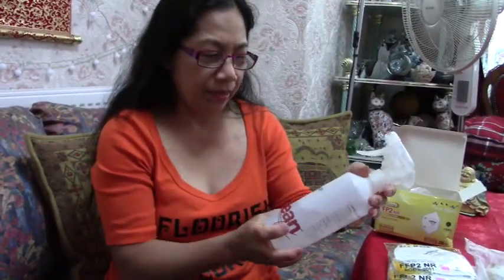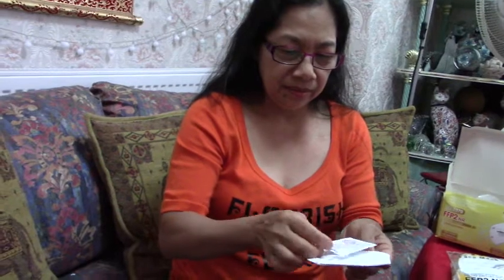I need to wash my hands with this. It's 70% alcohol, so it kills 99.9% of germs. And viruses. Yes, and viruses. Okay, so I'll take it from there. Put it there. Oh, so there's the thing.